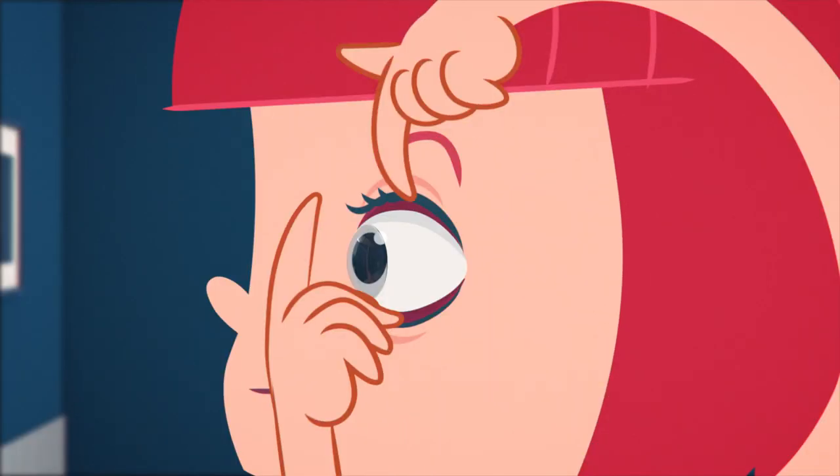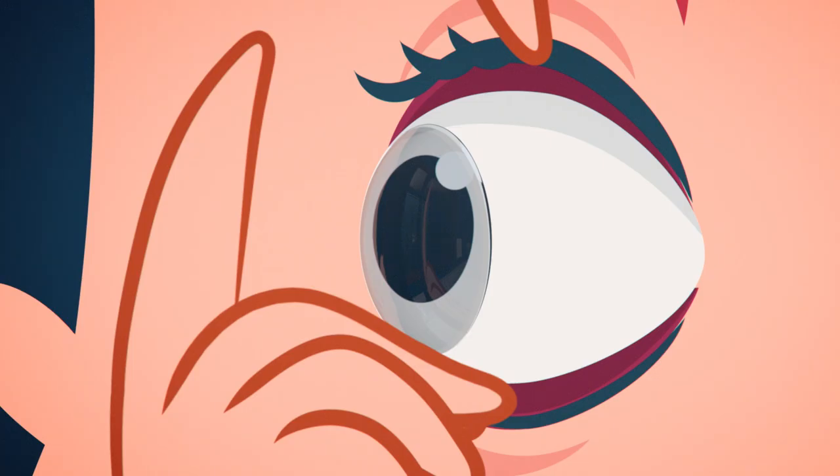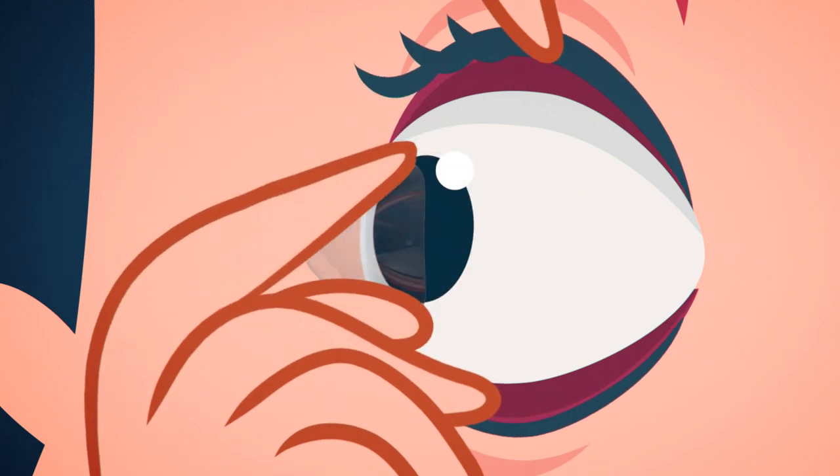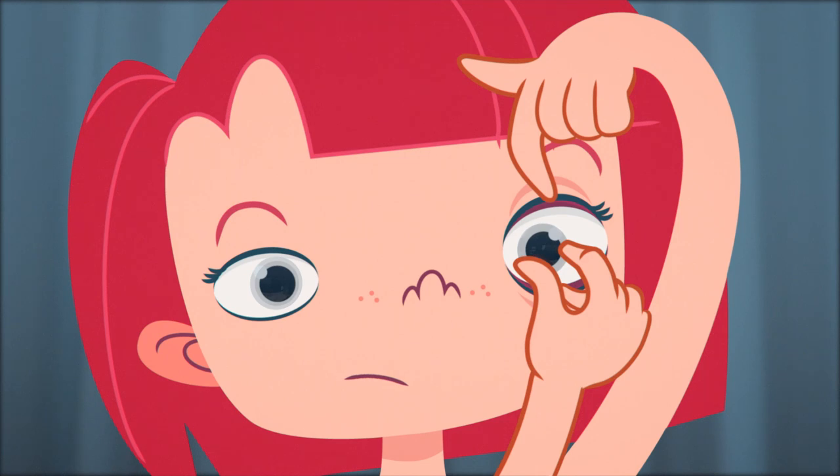Take a deep breath and relax. Now, with the thumb and forefinger of your bottom hand, gently pinch the outer edges of the lens towards each other. The lens will bow and come away from your eye as you continue to pinch your fingers together. Don't worry, it may take a few tries.